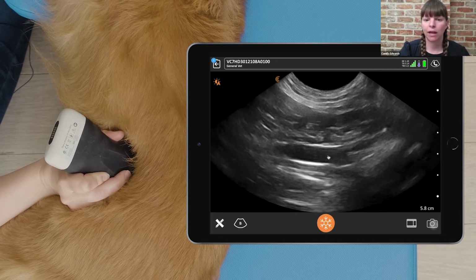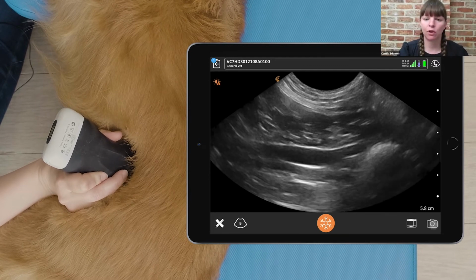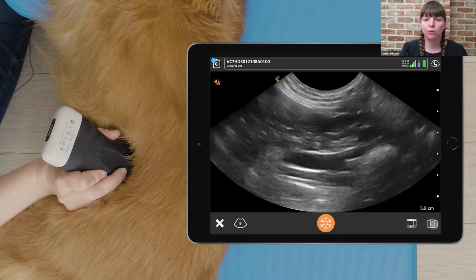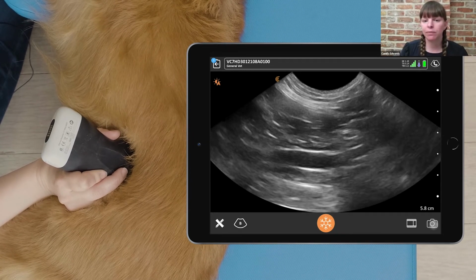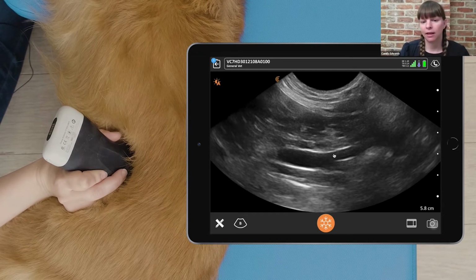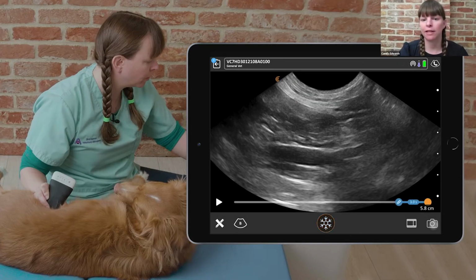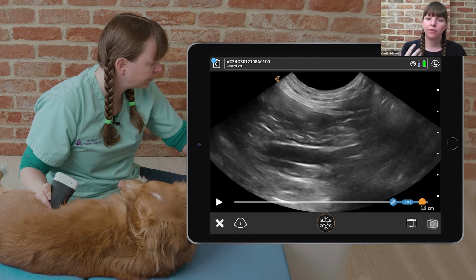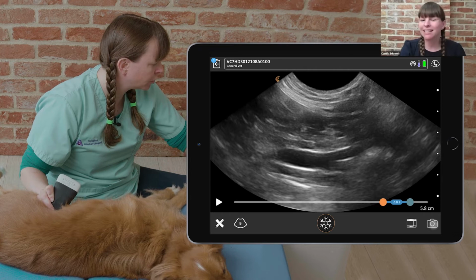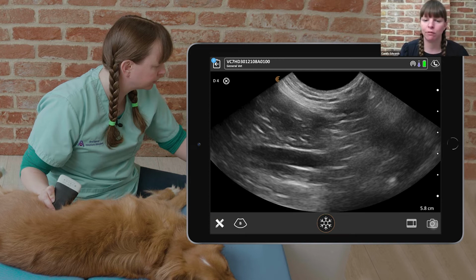So that trifurcation is happening here. We've got the aorta running along here, and then we have the trifurcation. And we fan in that area. It can be useful to release some pressure. That gives us a bit more room between the probe and the aortic trifurcation for us to look in for this lymph node in this area. But sometimes the descending colon can get in the way, and we'll need to apply a bit more pressure to get that to move out of the way.